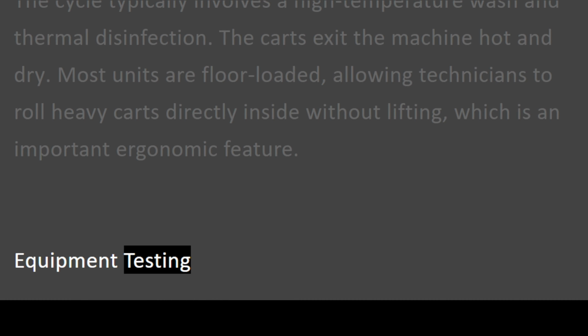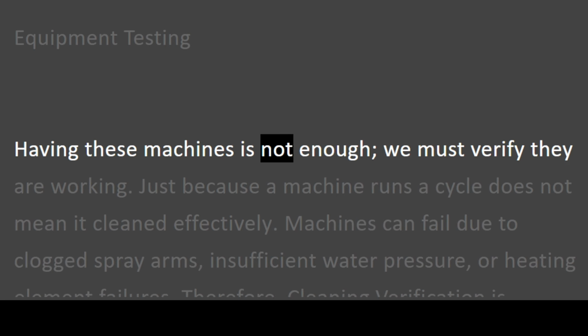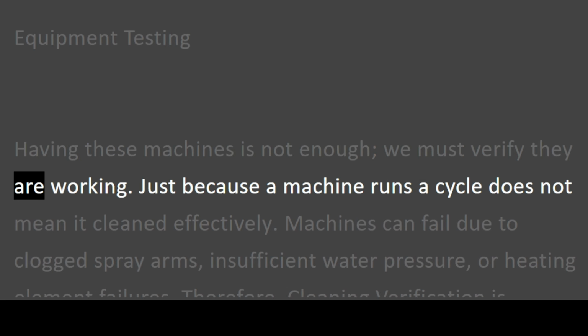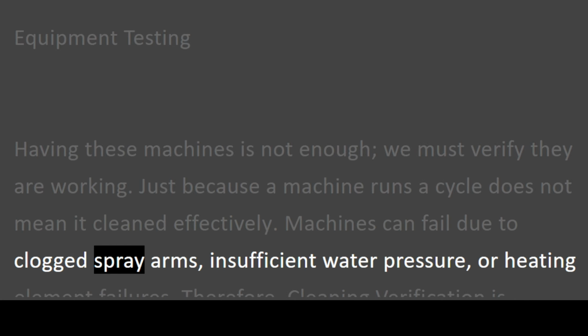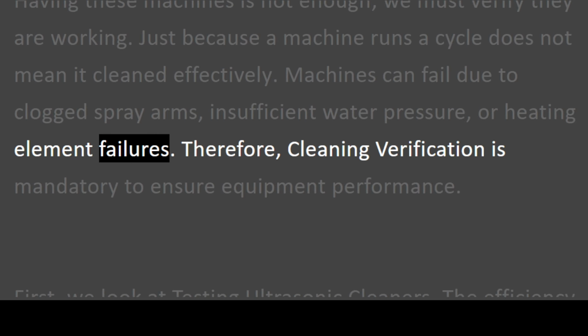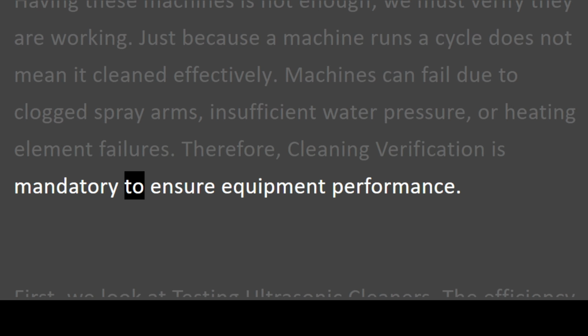Equipment testing. Having these machines is not enough. We must verify they are working. Just because a machine runs a cycle does not mean it cleaned effectively. Machines can fail due to clogged spray arms, insufficient water pressure, or heating element failures. Therefore, cleaning verification is mandatory to ensure equipment performance.